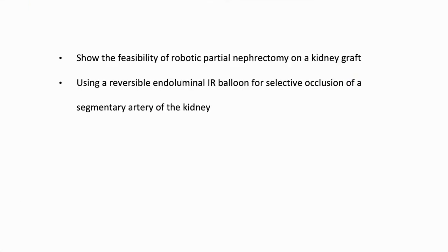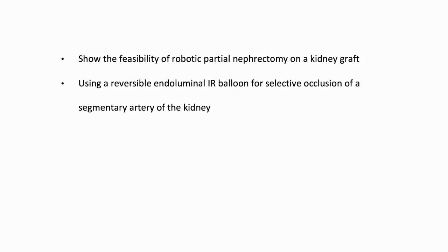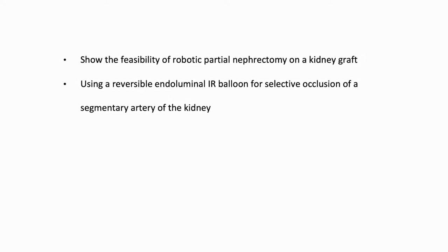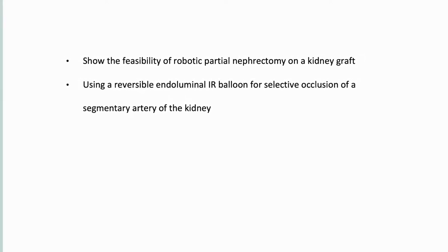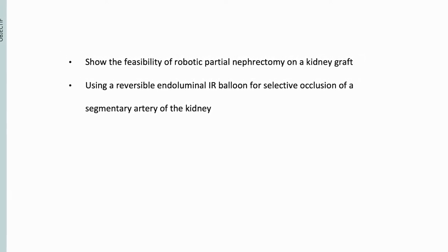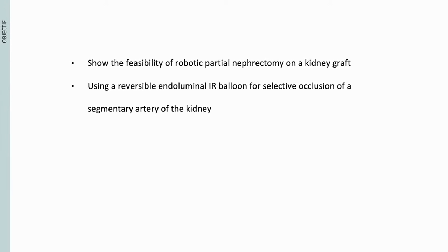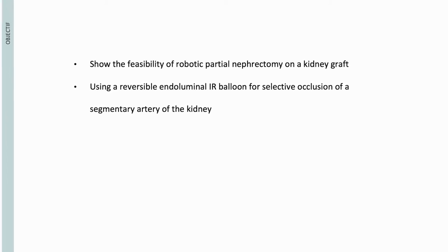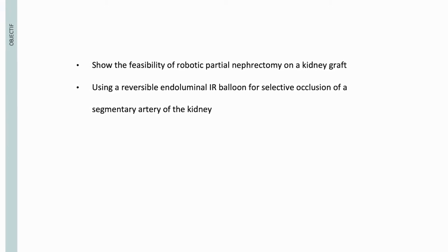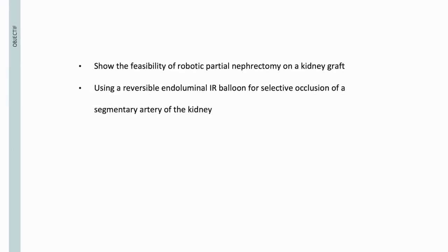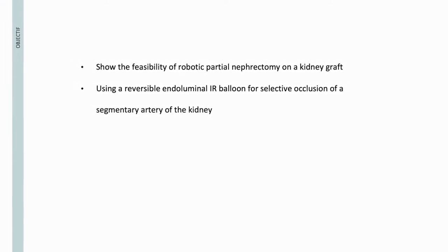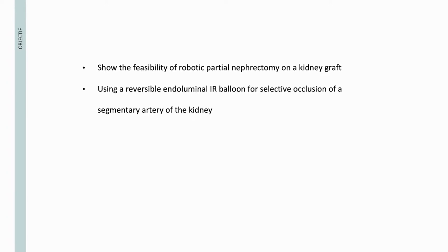The objective of this clinical case was to show the feasibility of robotic partial nephrectomy on a kidney graft, using a reversible endoluminal balloon for selective occlusion of a segmentary artery of the kidney.